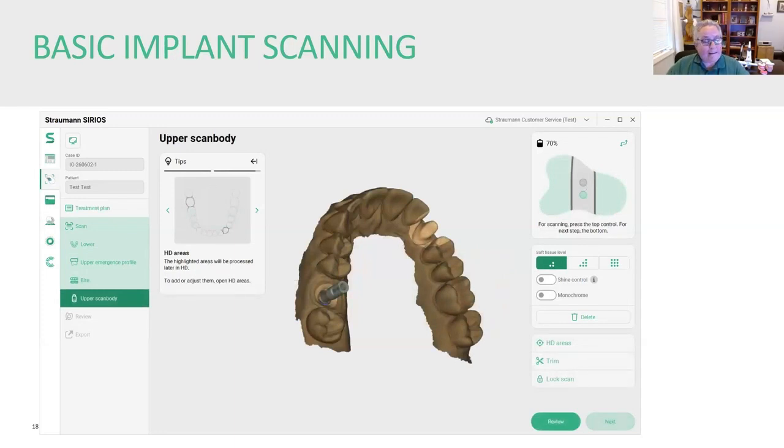The scan body, you can scan obviously any scan body you're using as long as your lab accepts that scan body. That's the critical thing. Make sure you're using a scan body your lab can work with. Okay. And the important thing about capturing the scan body is, of course, getting it from all angles.